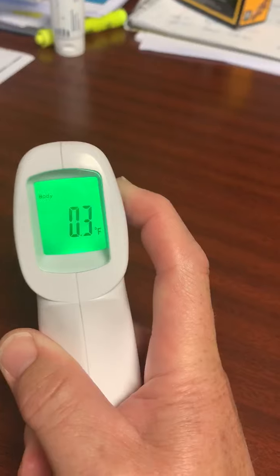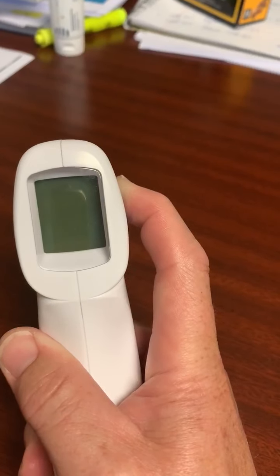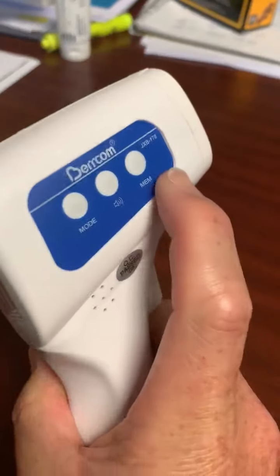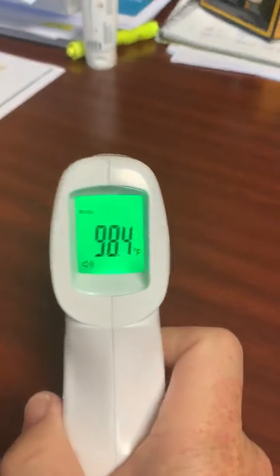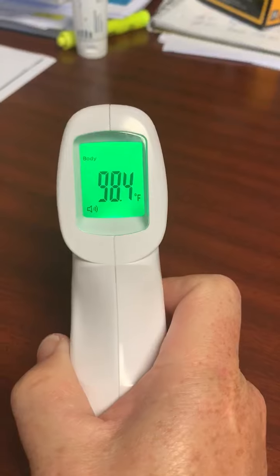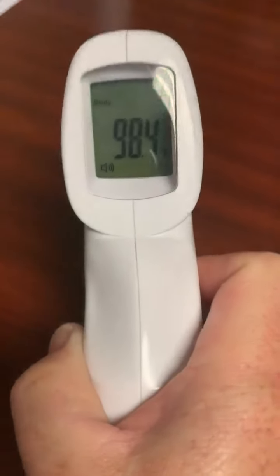You'll get your best readings between 0.3 and 0.5. I'm going to lock this in by hitting the memory button one time. Now I'm going to come back and take my temperature again — 98.4 is what I've registered. This is a temperature that I would expect.